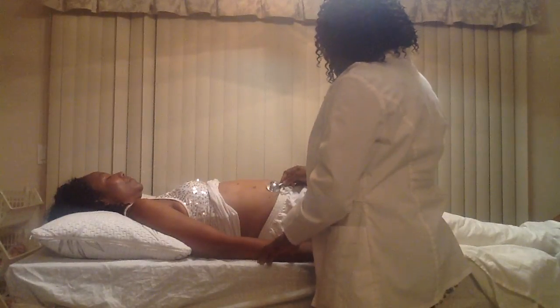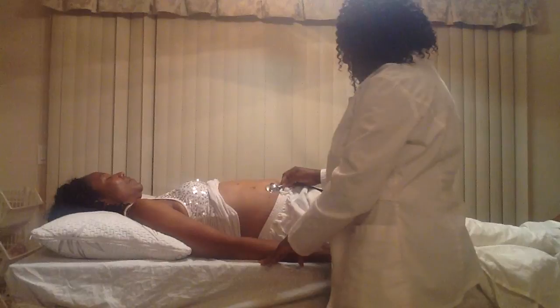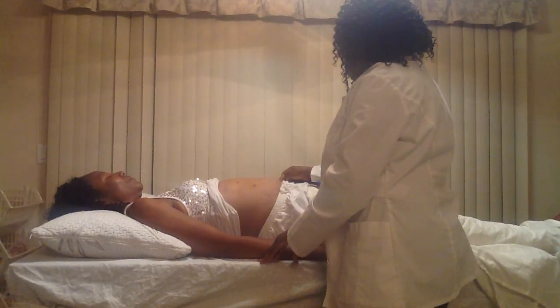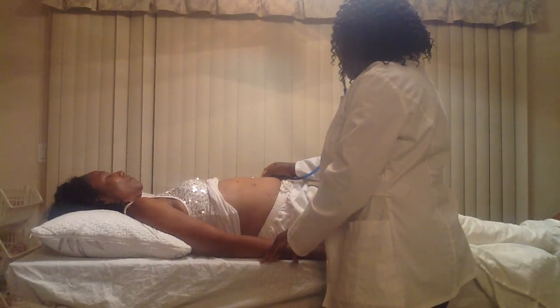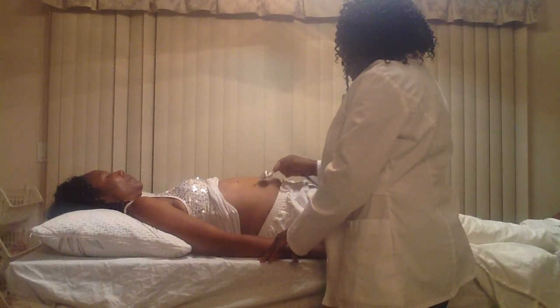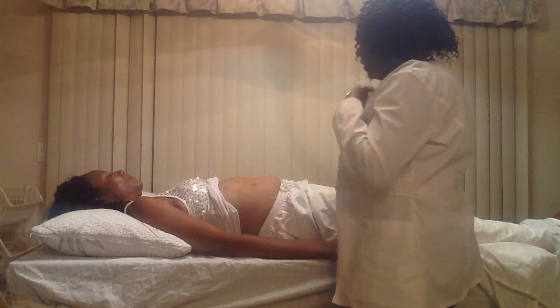Okay, so come closer to me. All right, so the next thing we're going to do is auscultate the abdomen. We'll be listening in all four quadrants for bowel sounds. Sometimes we can get hypoactive bowel sounds, which could be from obstruction. You can have hyperactive bowel sounds, or you could have absent bowel sounds. So far your bowel sounds are normal.